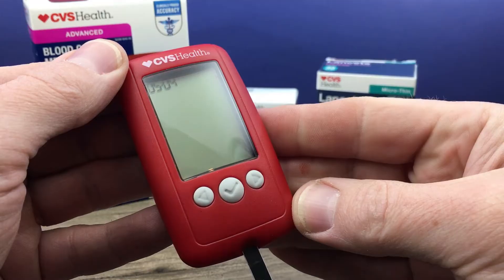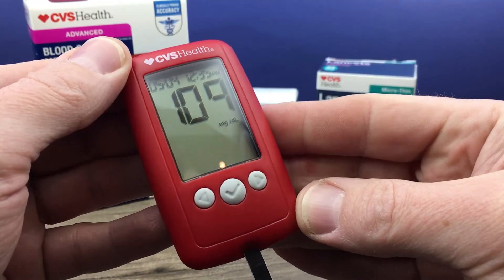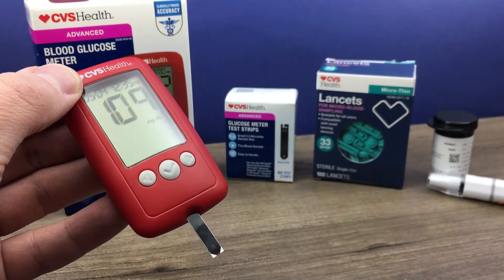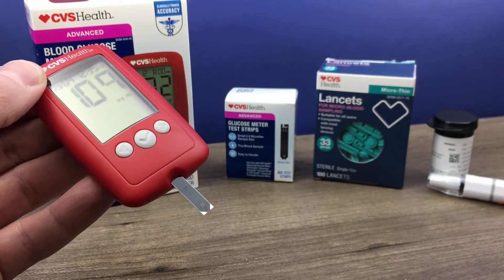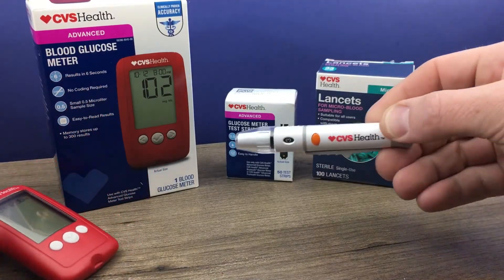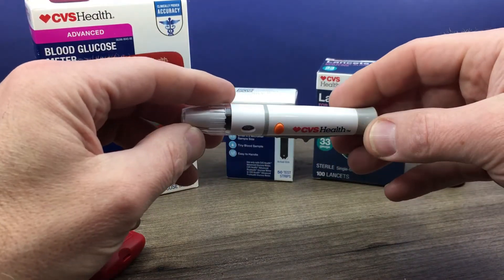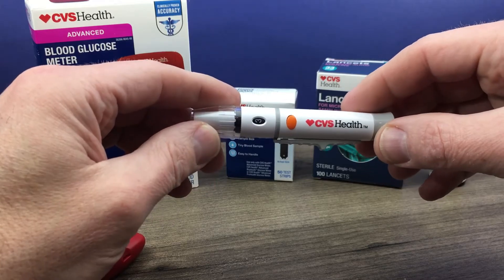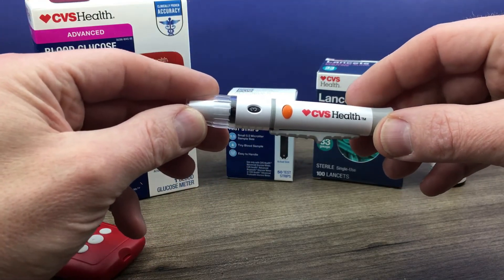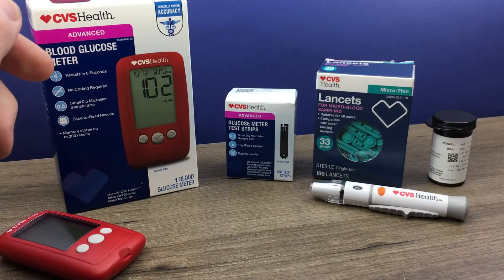Now it's performing our test. There is our reading: 109. Pretty simple basic operation. Remember, test strips are just one-time use, so you want to properly dispose of that. Lancet devices are for single person use only, so make sure you never share that. And the lancets themselves are also one-time use items, so be sure to change that each time you use it.